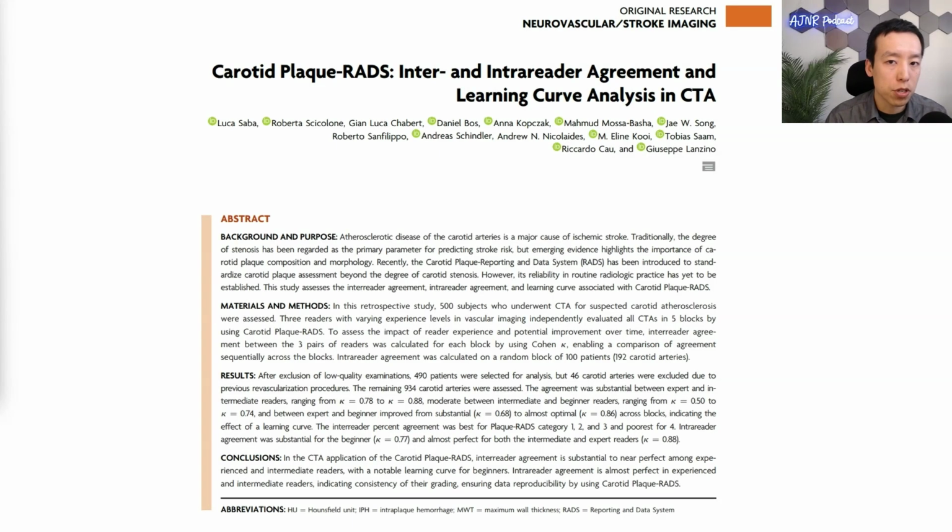Now, the first paper I want to show you is by Lukasaba and colleagues, published in the AJNR in October 2025. The title is Carotid Plaque-RADS Inter- and Intrareader Agreement and Learning Curve Analysis on CTA. The idea is whenever you propose a classification system, the first question you have to ask is basically, can radiologists even use this consistently? And as an educator, I really love this kind of study because it can give guidance on how much exposure and practice we need to ensure our trainees get, or even practicing radiologists as they're first being introduced to this system.